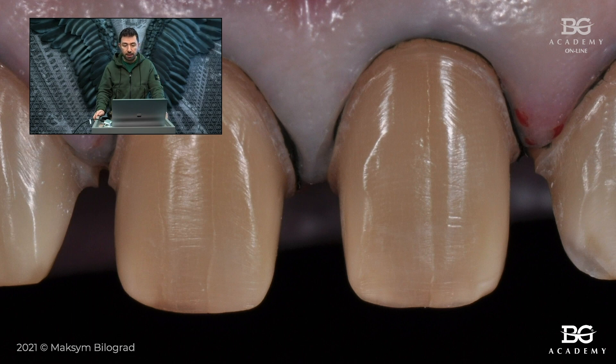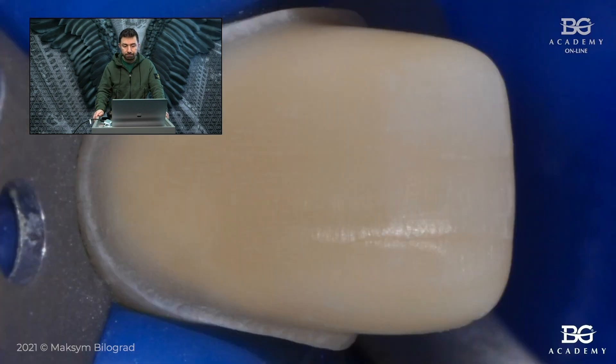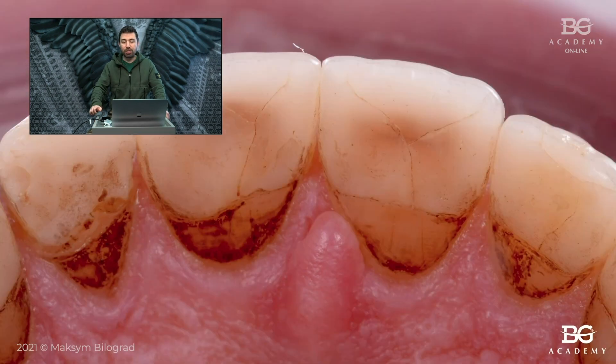But after a certain period of time I faced a problem. Let me show you a few more macro pictures of the prepared frontal teeth, and then the final restorations — they are Emax cutback and layered crowns, with rubber dam isolation prior to bonding. Straight after cementation, this is the lateral view. Four years later — the patient is a heavy smoker so dental hygiene was not very good — I would like to show you the palatal side of the crowns where we can see multiple cracks and even one piece of ceramic missing on the lateral incisor.